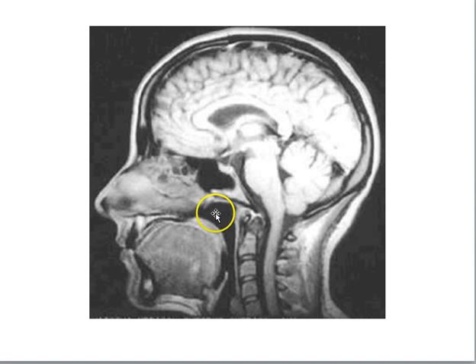Let's take a look. This is something you might see then, for example, in an MRI. So you can definitely see the difference between, say, brain. So here's the brain up here. We've got the skull here. We've got the sinuses. We've got the spinal cord. We've got vertebrae and the tongue and so on. So different types of tissue end up giving off different characteristic signals, and that's what allows you to see the detail in the image.